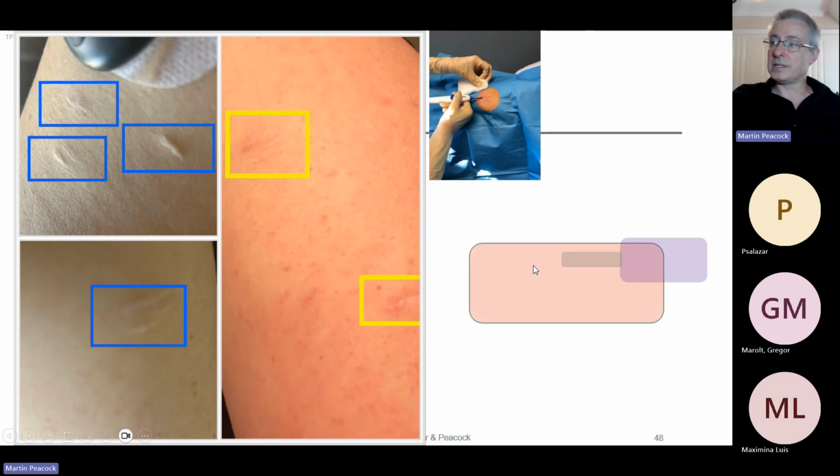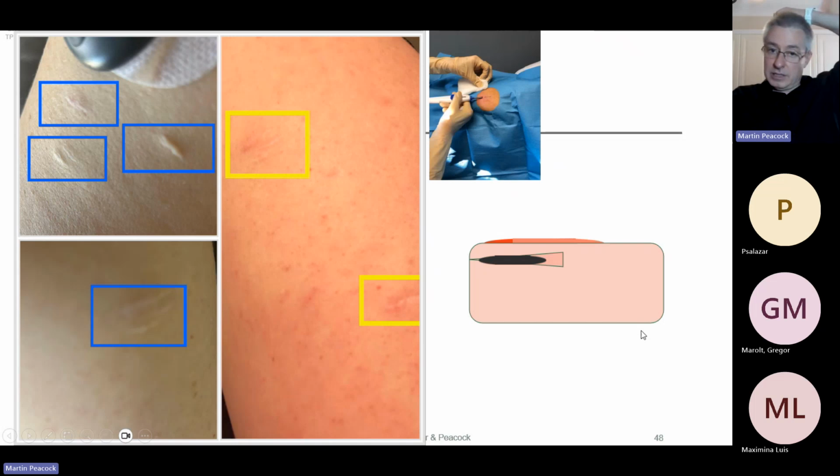These things are implanted: the sensor is put into the body underneath the skin, and then the injector is retracted. But we have a suspicion that the sensor is slightly migrating. It's unfortunate, it's a sort of torpedo shape. Essentially, these lines are like tracks, as the sensor migrates through, it leaves these tracks. And then people are getting a little scar from it. I'm not sure if you could call that a scar or a blemish, but that is something that's happening.